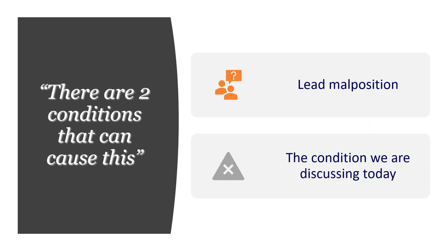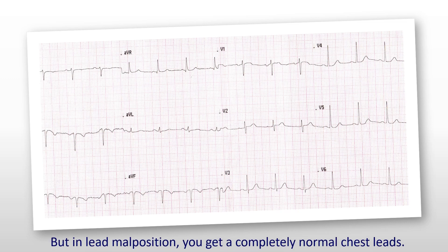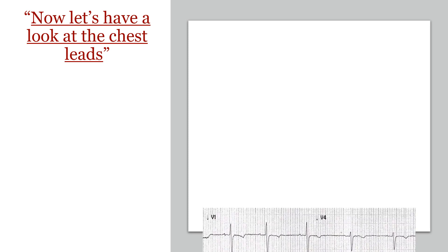When you see these changes, there are two conditions that can cause this: lead malposition or the condition we're talking about today. Here is an example of a lead malposition ECG — negative P waves in II, III, AVF, negative complexes, negative T waves, and positive everything in AVR. However, with lead malposition, the chest leads are completely normal, because limb lead malposition only affects the limb leads. So with lead malposition, I would expect the chest leads to look completely normal.